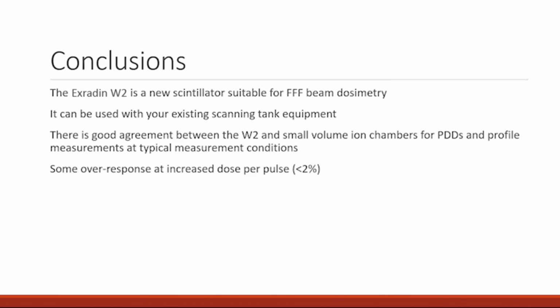Like I said, we do polarity for TG-51, and it's often right at 1.000. But as you know, best practice is to always do all the correction factors that you can, to be as accurate as you can, even if you expect them to be 1. Yeah, and I would add to that, unless you're measuring a 1 millimeter field, you will always have some part of the stem that's being irradiated. So you'll always have some contribution from Cherenkov, even if it is a small contribution.